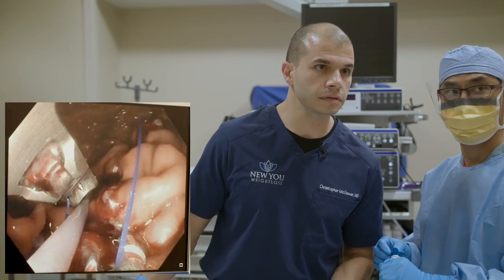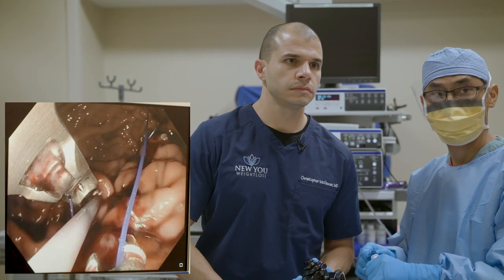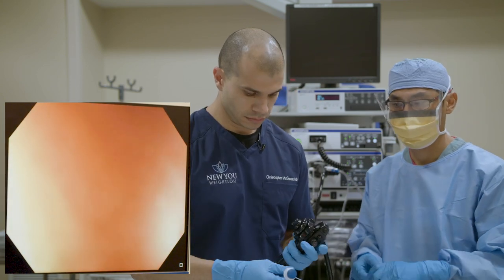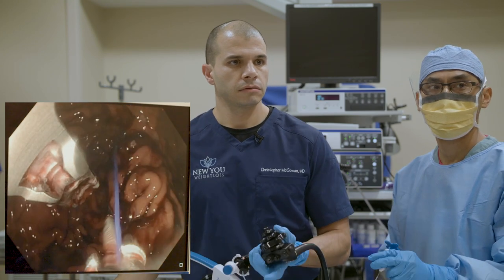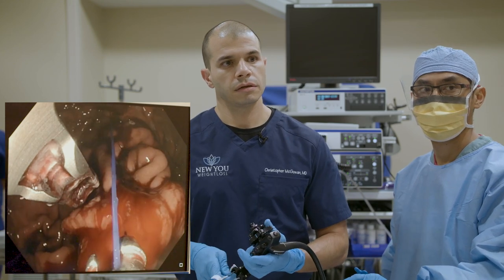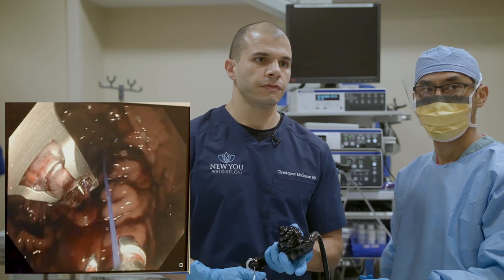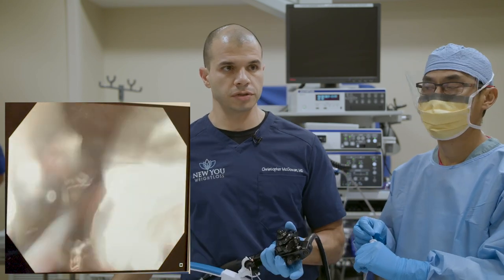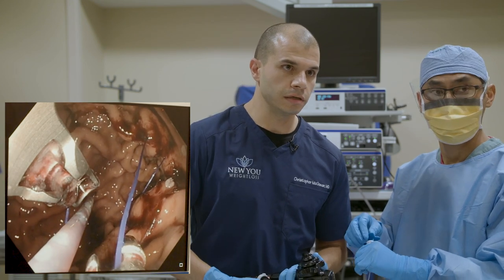Question from Becky: will ESG interfere with me becoming pregnant? It will not. We'd certainly want you to recover fully before thinking about pregnancy. In reality, you're likely to become more fertile after losing weight — obesity definitely interferes with fertility in some instances. So otherwise, no, it does not interfere. There was a moment where we drove the helix just a little too deep and adjusted — we definitely don't want to go too deep with our needle and hit something outside the stomach, so we're careful about that.